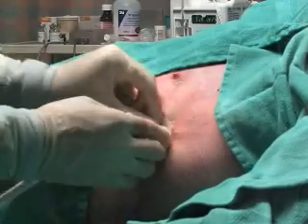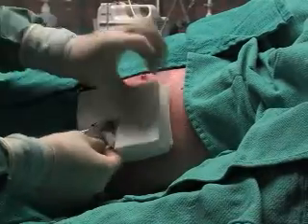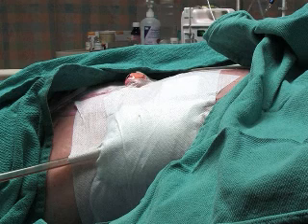Once the chest tube has been secured, a petroleum-based gauze dressing should be wrapped around it. Apply several pieces of sterile gauze around the tube. Secure the site with multiple pressure dressings. A chest X-ray must be done to confirm correct placement.